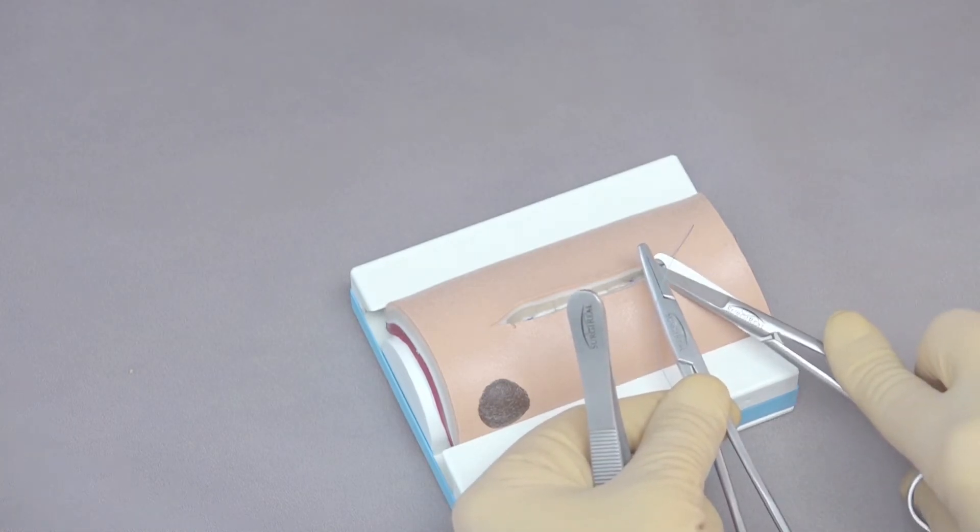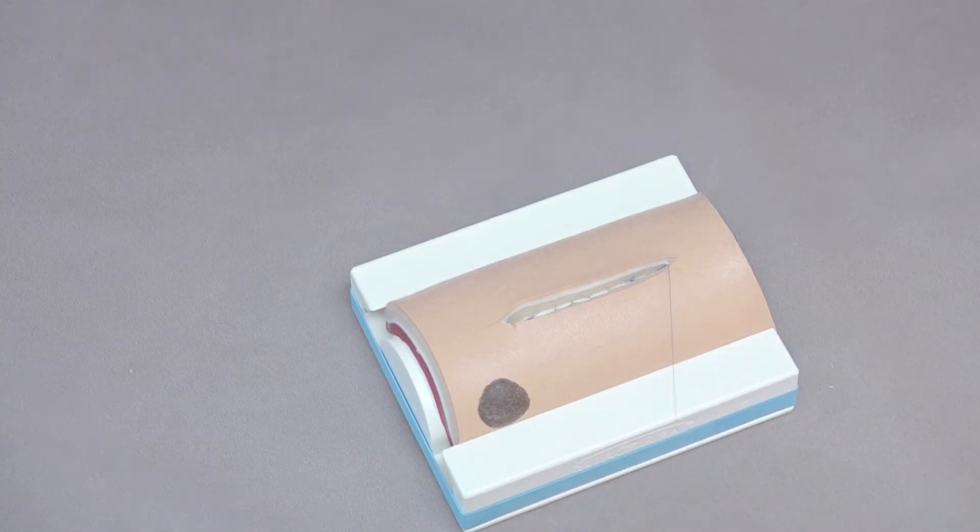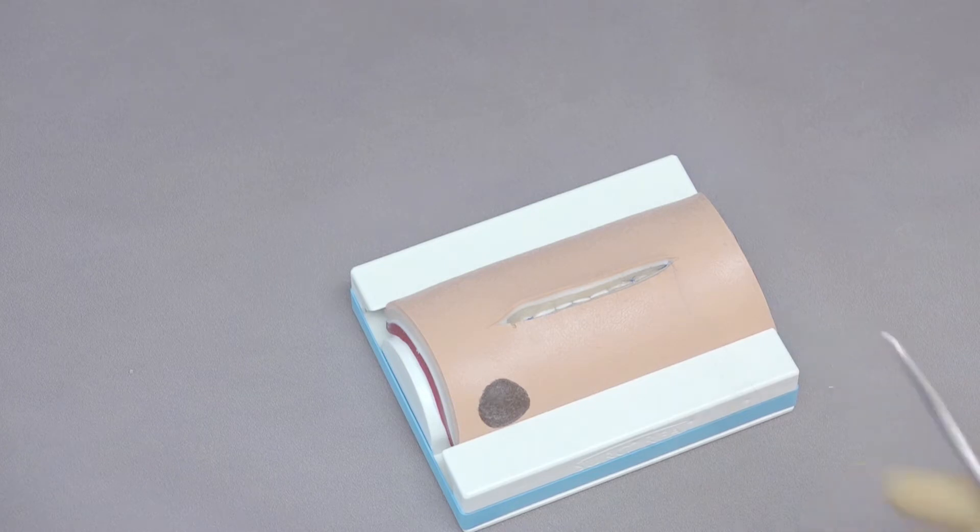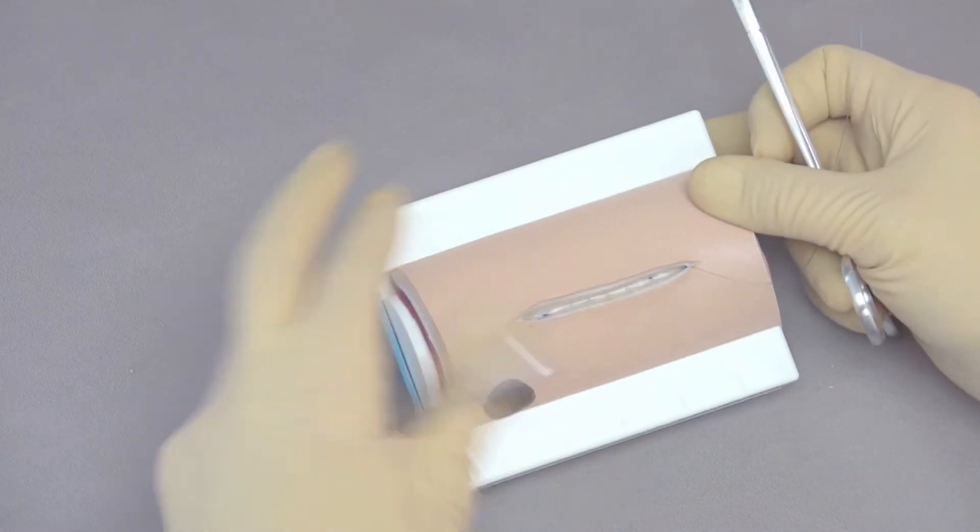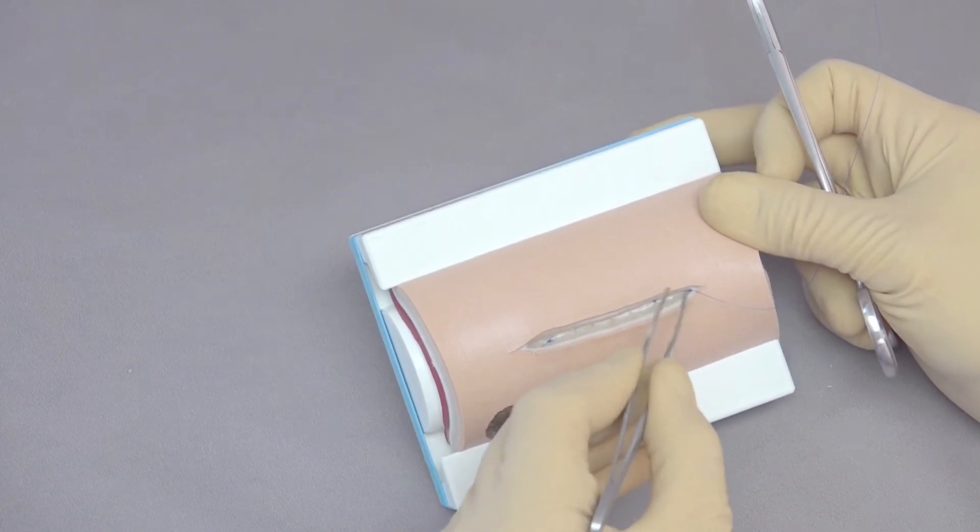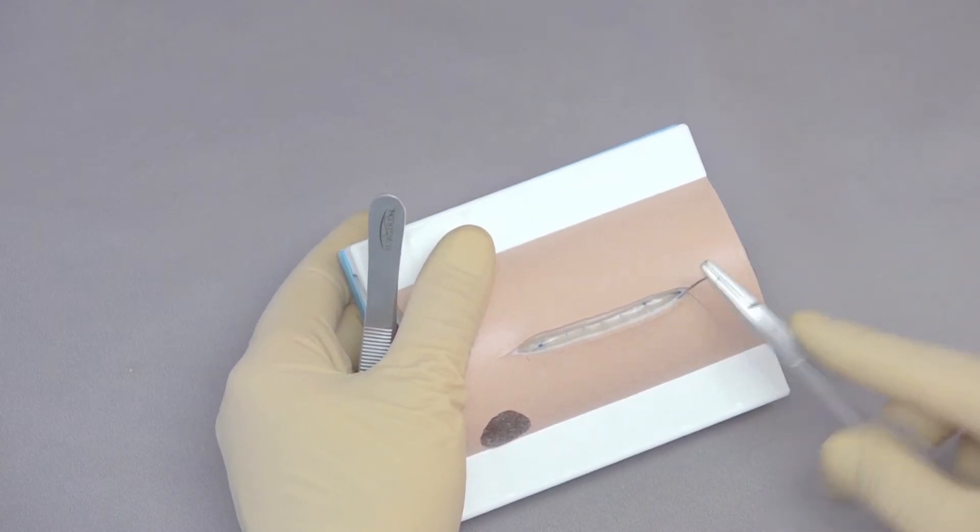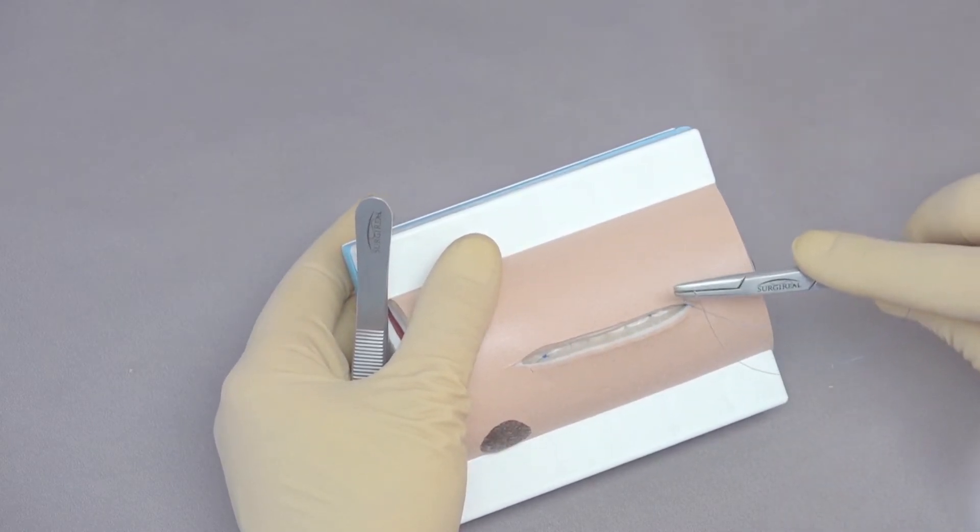We're going to cut just the short end because we're going to bury this knot and use a continuous. So if we were to cut both of those then we wouldn't have gotten very far down the line of doing the incision. Now you remember we started deep and we ended deep. So the next step is to stay deep, and that's where a lot of people make the mistake. So they'll start superficial when you really want to make sure you stay deep.